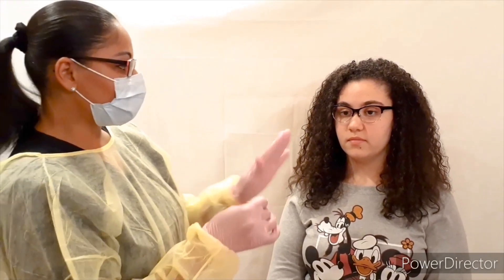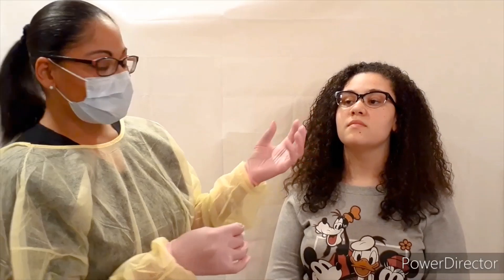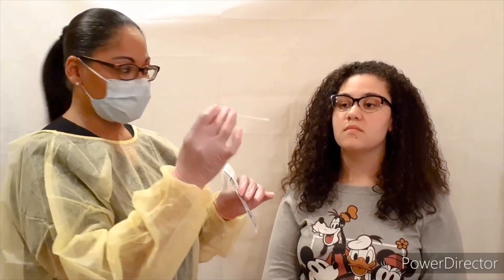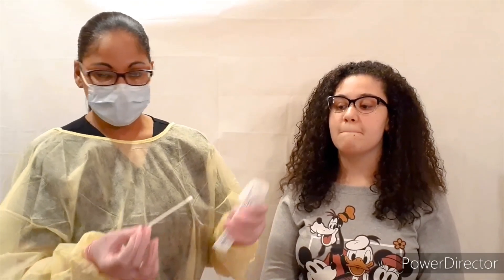I'm going to make sure that I'm protecting myself as well as making sure that nothing gets onto my face or my eyes, and also protecting my patient. What I need to do is have the patient tilt their head back. When they open their mouth and say 'ah,' it's going to cause the tongue to drop down away from the tonsils where I can actually swab the back of the throat — both sides of the tonsils — so that I can run the test for analysis.